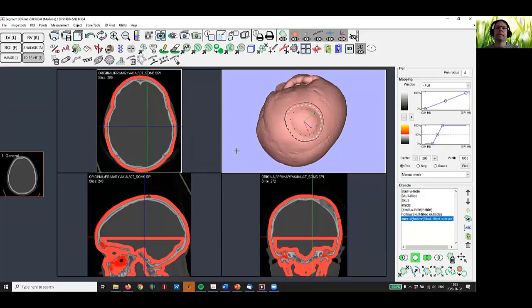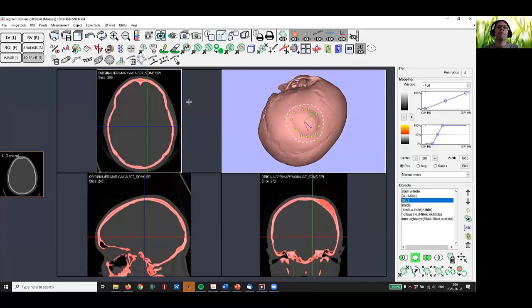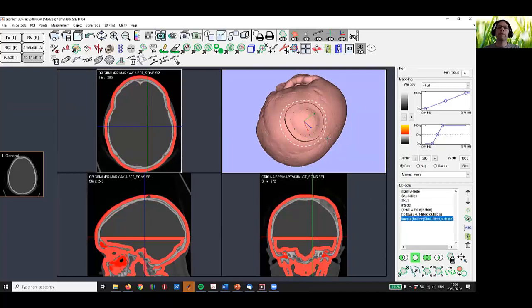Like this. And I take, and now we can go back to the skull. See, here's a line. And now if I move the line out, maybe 12 millimeters or so, like this, there, and we go back to the already cut helmet, and then we cut it again. So now I have created a ring that we can pick.